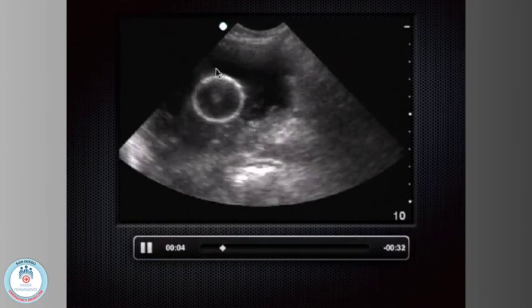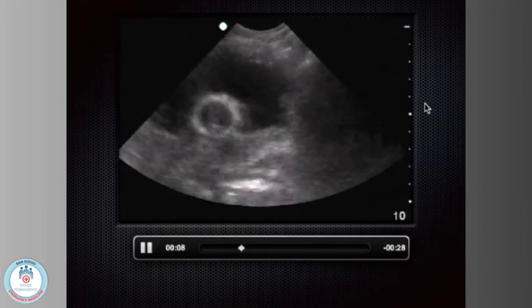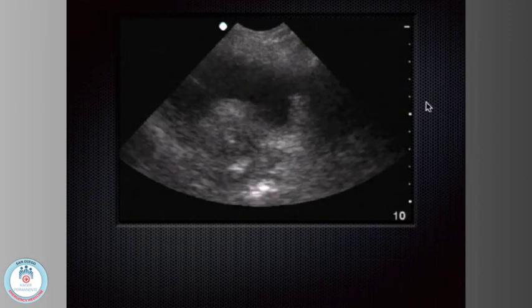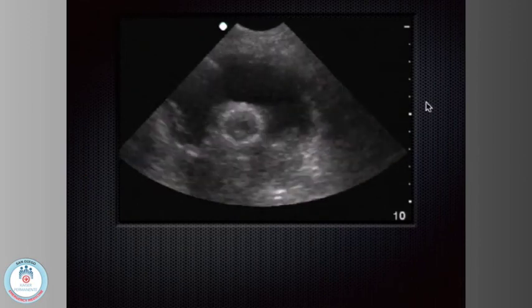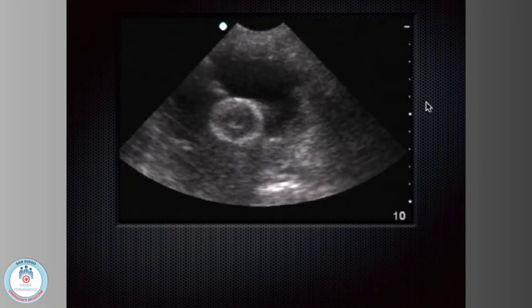We're almost done here, guys. This is the Foley balloon catheter right here. It's stuck in the up position. We can't get it out, and the patient's threatening to yank the Foley out themselves. It's tempting to sort of walk away, let nature take its course, but instead we go back in the room and we guide a needle down to the balloon.